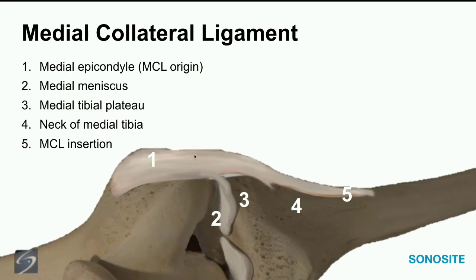I like to start out right here at the medial epicondyle of the femur. Just like the lateral aspect, there's a big bony protuberance sticking out of the medial side of the knee. And if you're all at home palpating the inside of your knee, you might feel the joint line, go proximal about an inch, and then feel for a bony rooftop feel. It's very prominent. It's easier to palpate than the lateral epicondyle, I feel.